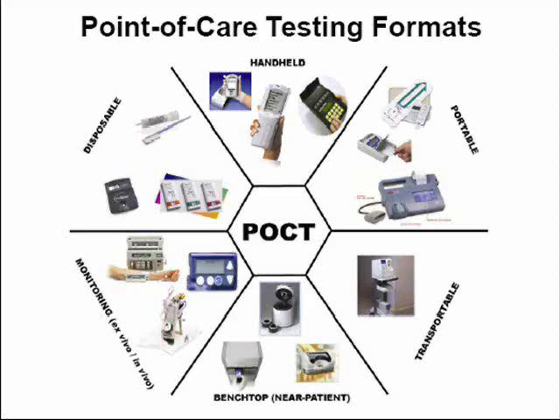On the upper left of this category, we have a handheld glucose meter. And then on the upper right, we have a unique instrument, a product of Lawrence Livermore National Laboratories, called the Handheld Nucleic Acid Analyzer, or HANA, H-A-N-A-A. And this device targets biothreat agents such as anthrax.